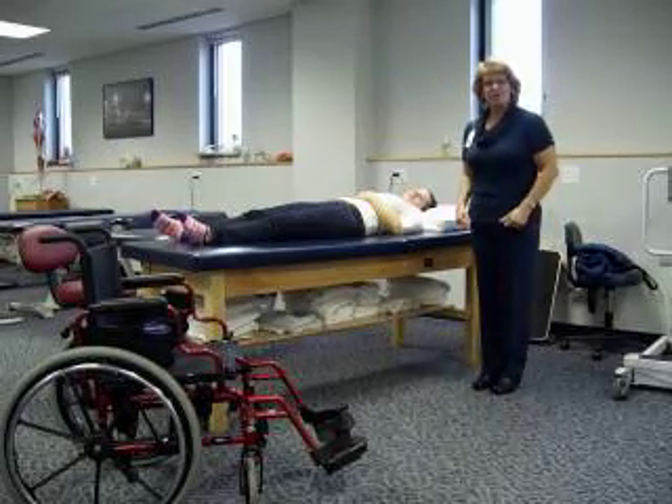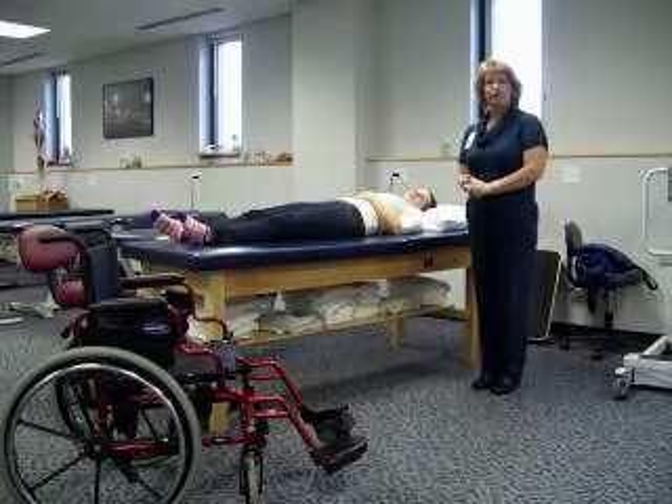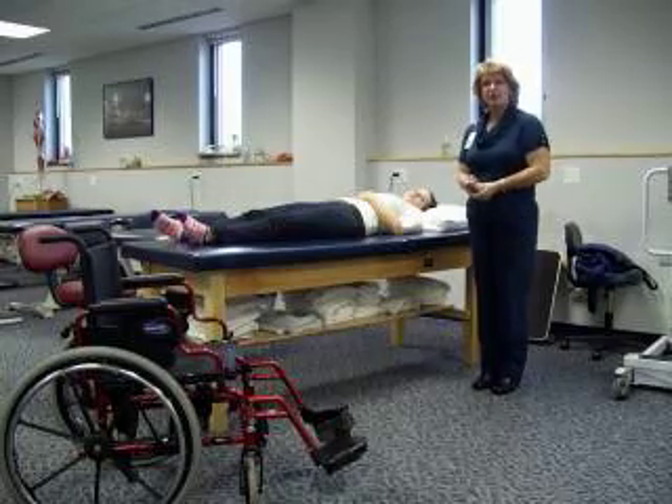We're at Kellogg Community College, and we're going to be showing how to use a solid sling for the Hoyer lift. We have an electronic Hoyer lift that we're going to be using.